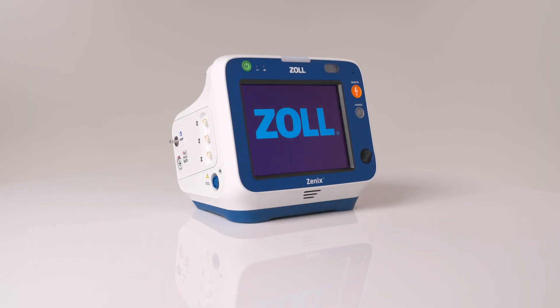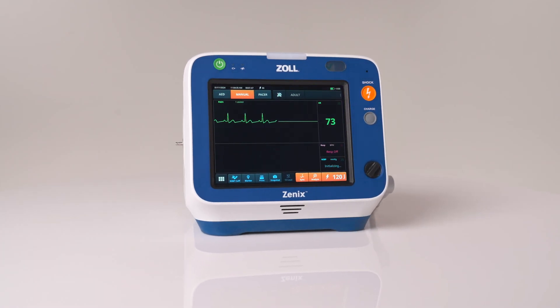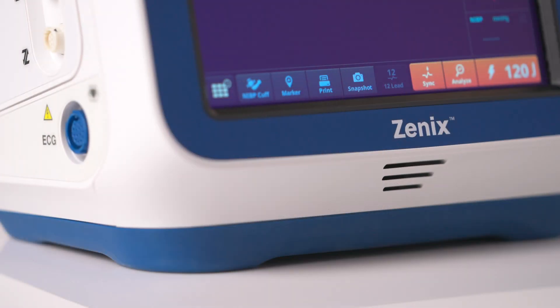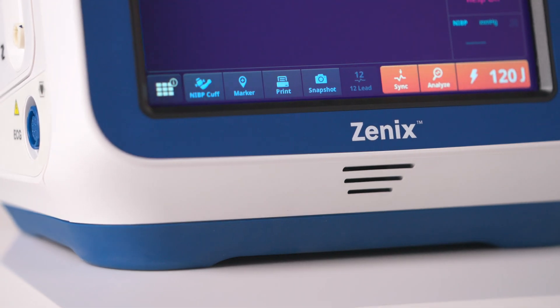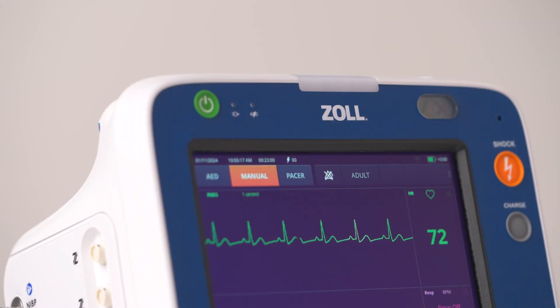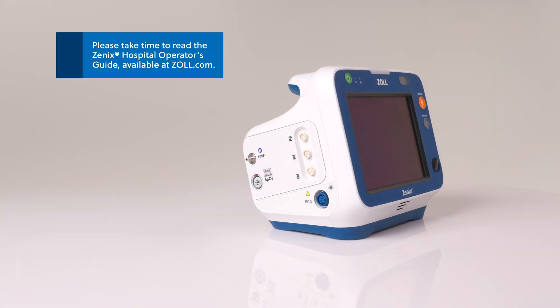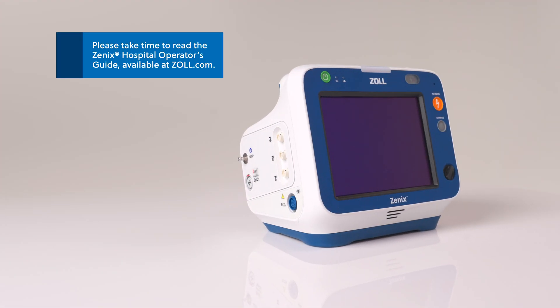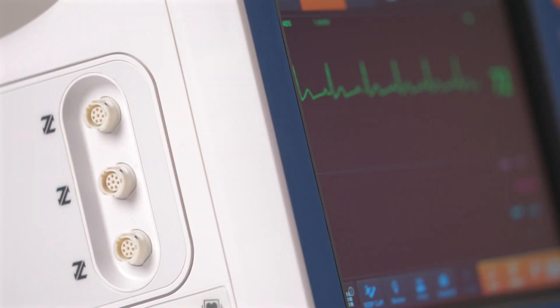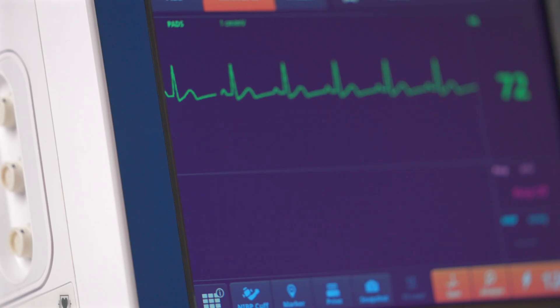Welcome to the Zenix Hospital in-service tutorial video series. This series provides detailed information about the Zenix monitor defibrillator and its functionality. These videos serve as an adjunct to formal training. Please take time to read the operator's guide available online at zoll.com. Obtain formal training from an appropriate authority before using Zenix for patient care.